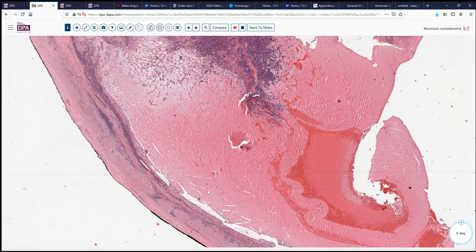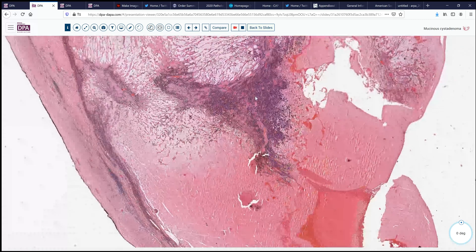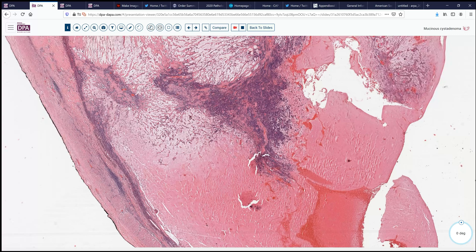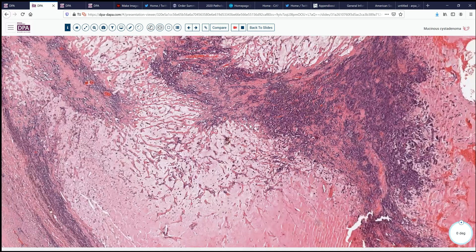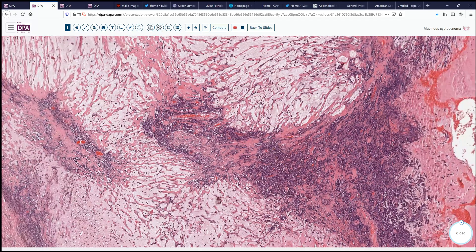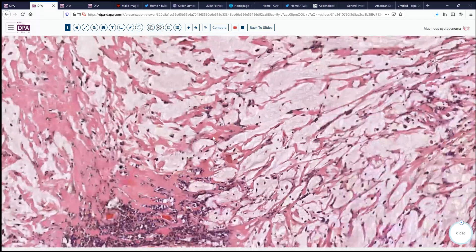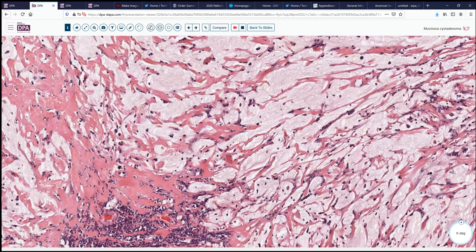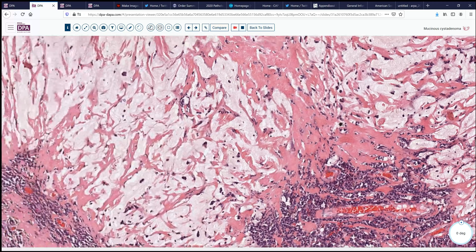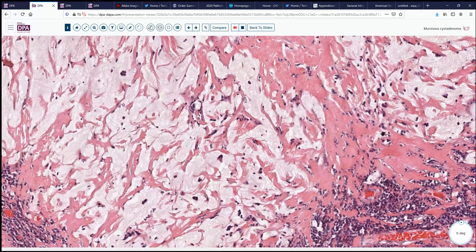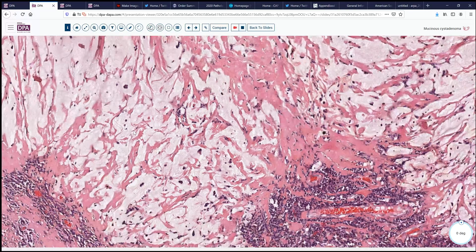Coming along further to this area, we see it's much more inflamed. There's been more disruption of the wall. There's fibrin or fibrosis here, this inflammatory material as well, and this pattern of sort of dissecting mucus. But looking at this closely, we don't really see anything that looks like definite epithelial cell groups — maybe a few things like this. We might wonder, could they be histiocytes? Could they be epithelial cells?